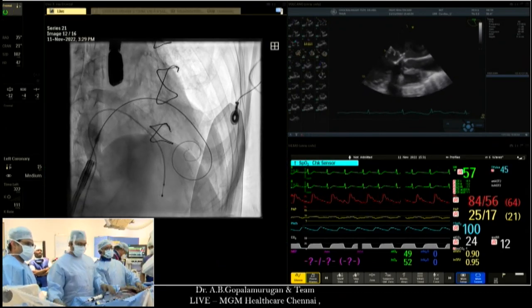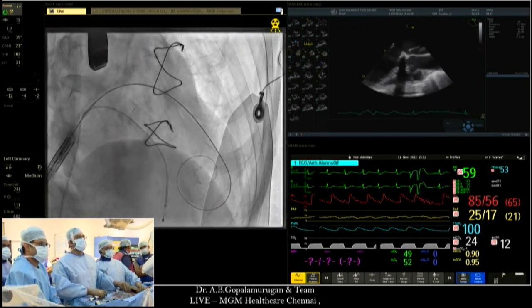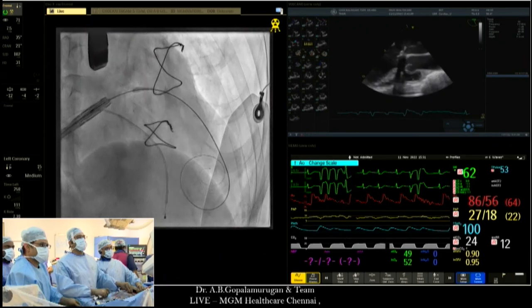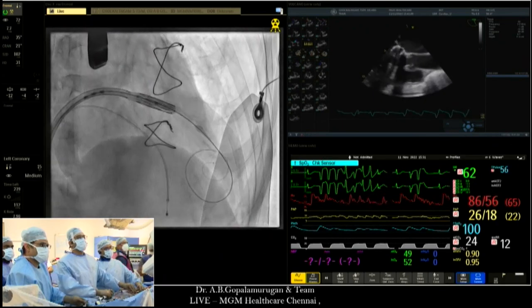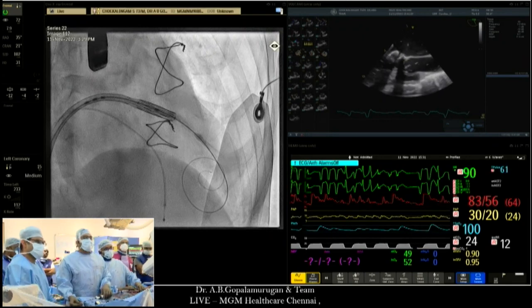Okay, Abu, you're going to adjust the wire for me? Smooth. Okay, there you go. Easily crossed. Very nice.